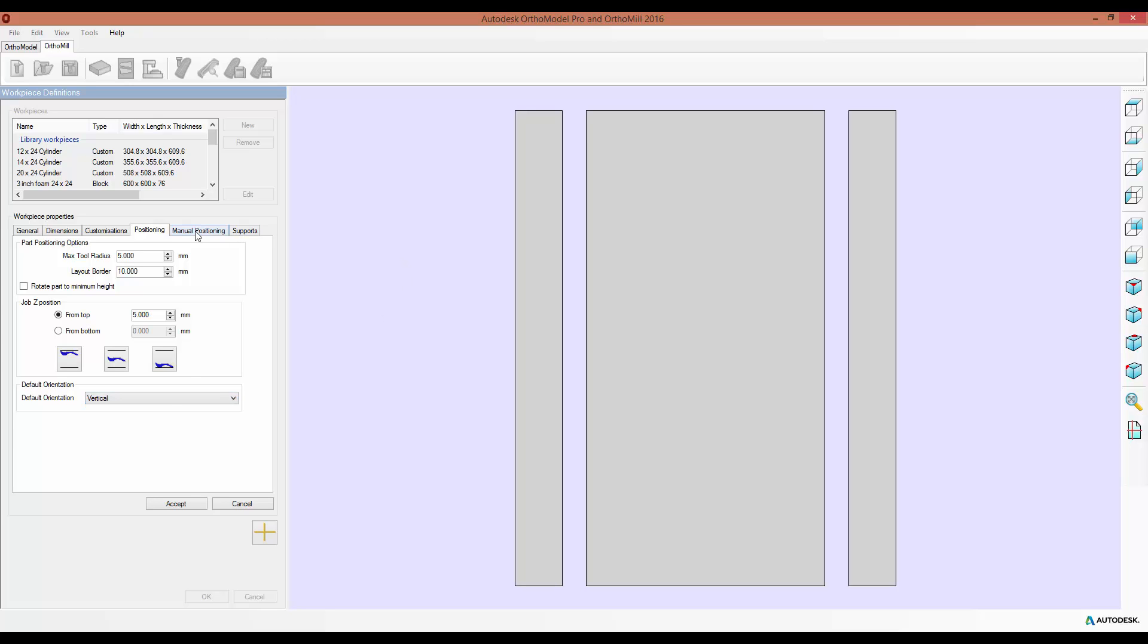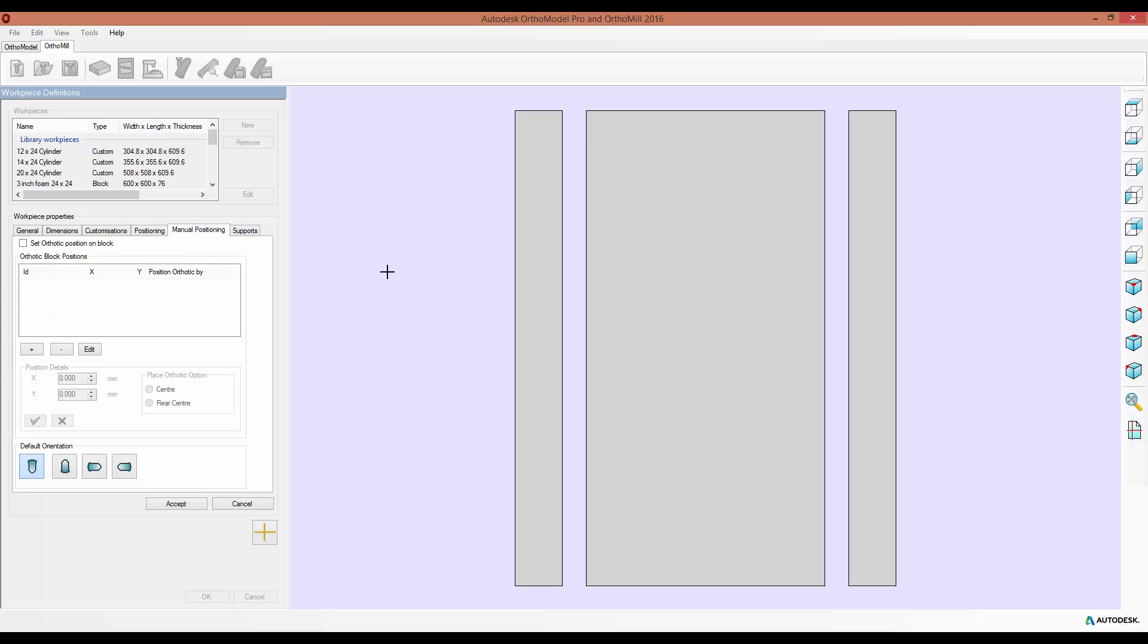In the Manual Positioning tab, this is more for if you're working with a small block, say you can only fit a single pair of insoles. You can select to set their position on the block as the same each time, and then add your own positions and change the X and Y coordinates to set them.